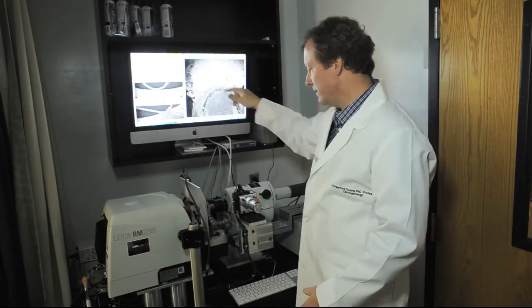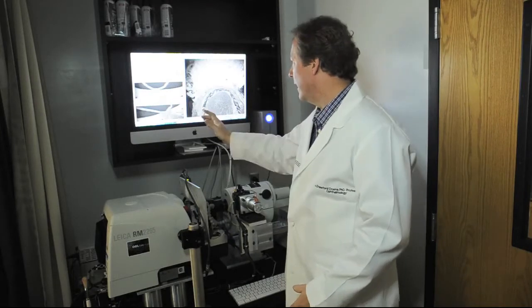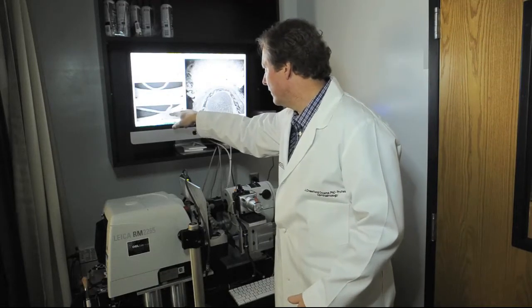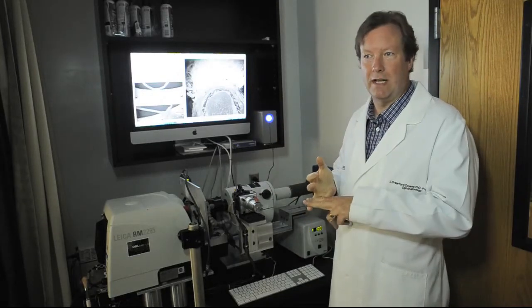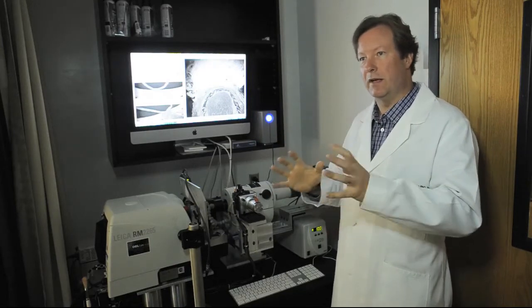So this is the en face image, what it's actually seeing, and this is a slice through the image. This is a vertical slice, and this one's the horizontal slice. And so here you see sclera, retina, optic nerve head, lamina cribrosa, and all those things are what we assess in our studies of age and race-related susceptibility to glaucoma, and how those things are related to intraocular pressure and fluctuations.